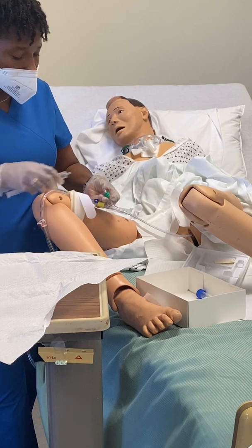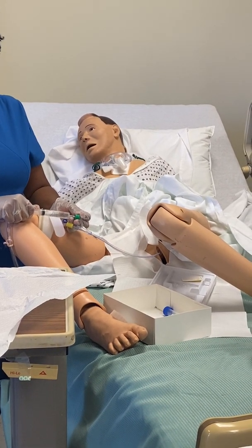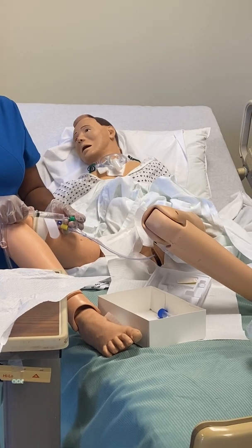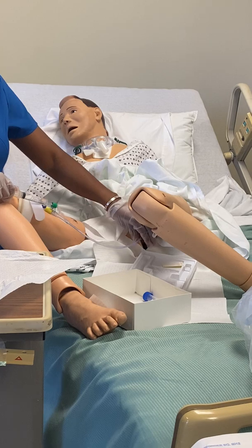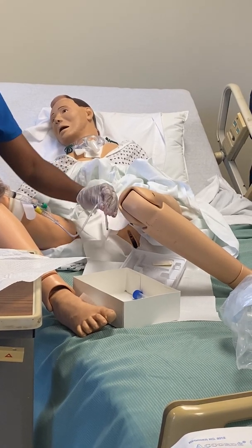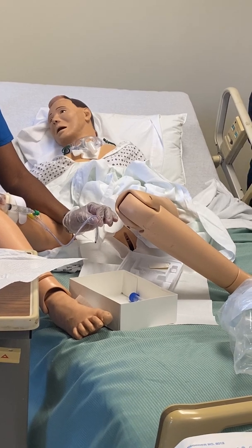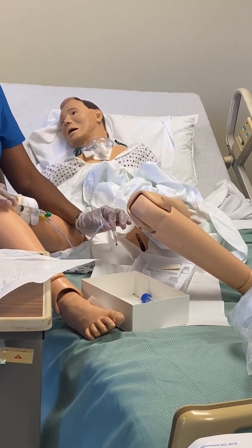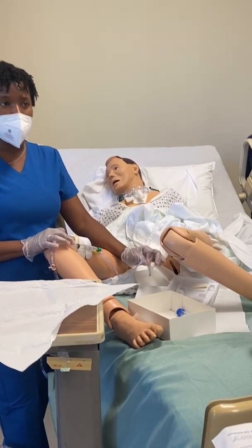We're going to connect the syringe, and we're gonna aspirate the fluid back, okay? And once I get 5 mLs or I meet resistance, I know I've gotten all the solution out. And then I'm gonna just tell them to take a deep breath and I'm gonna pull it out. Now what do you think this is gonna look like? Yucky. Because it's been in for a few days, sometimes all 30 days, and you're just replacing it, okay?